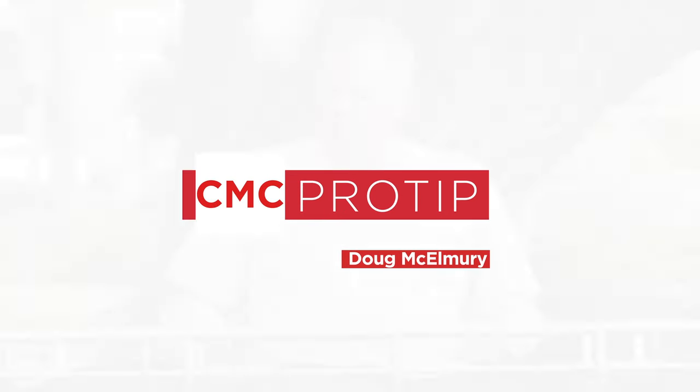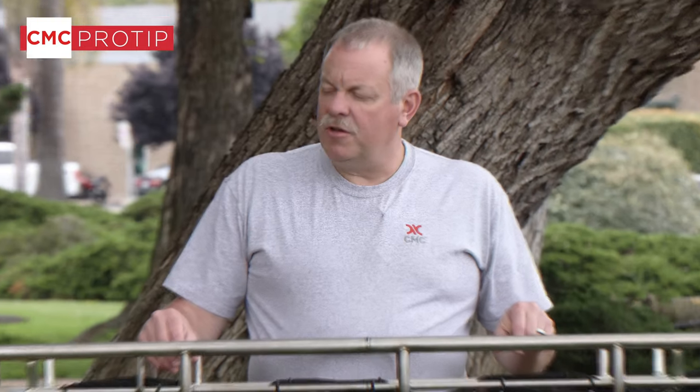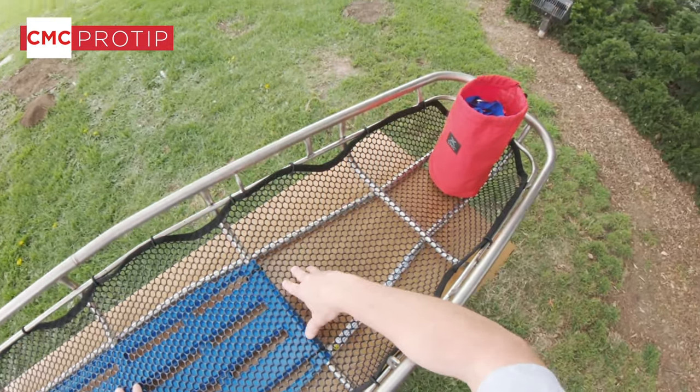We have a CMC pro tip video. Today we're going to talk about how to install the patient tie-in system along with the pelvic harness.